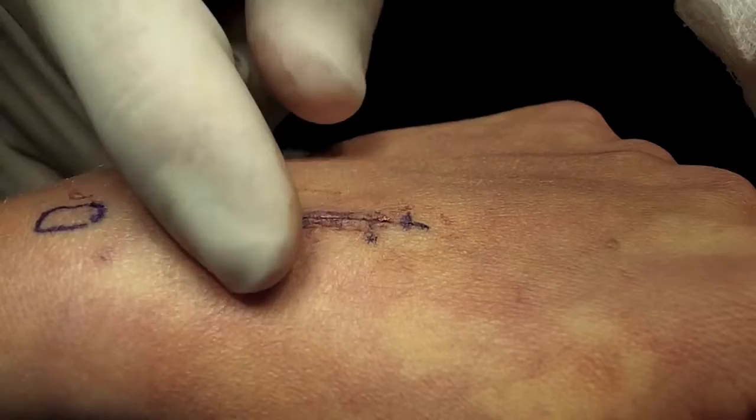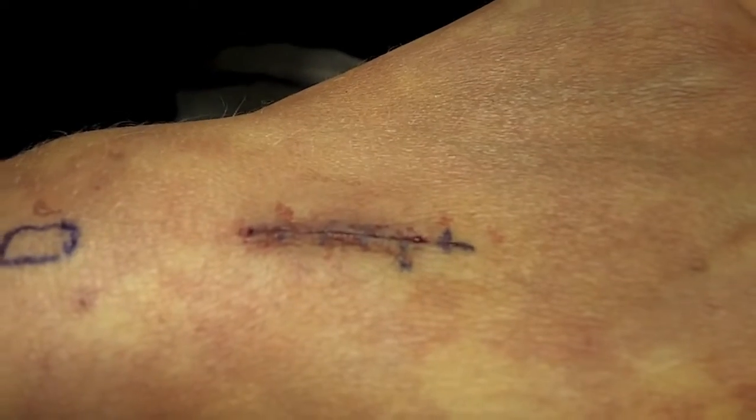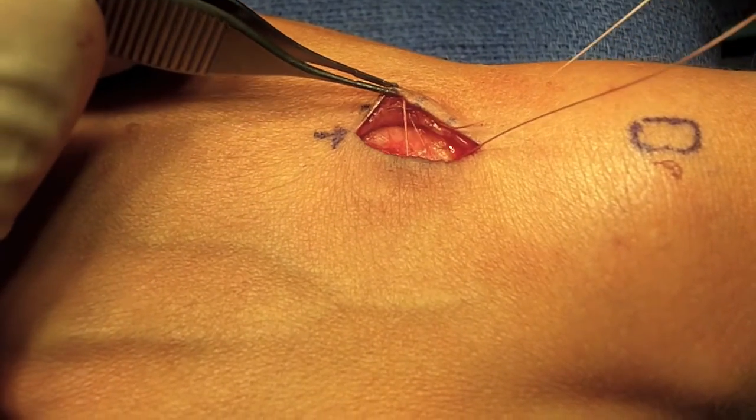In this video, I'll show you how I use a suture technique that buries all the stitches underneath the skin. This technique is not appropriate for all surgeries, but I try to use it whenever I can. This eliminates the need for suture removal in the office, which causes discomfort for some patients.